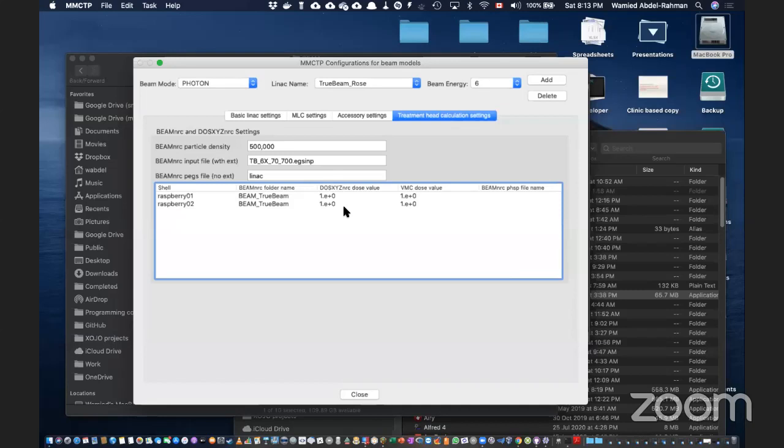Okay, this is something I'm really struggling now to define an output for, because Monte Carlo, remember, just gives you a dose per incident particle. How can we translate that into an MU? Because in a plan, we get 100 monitor units, 200 monitor units. How is that translated? So there is a calibration for that.